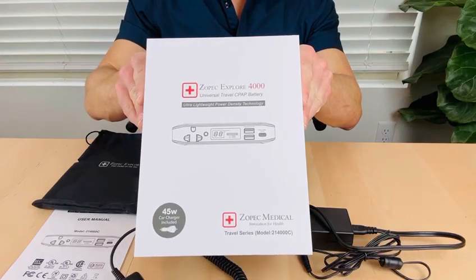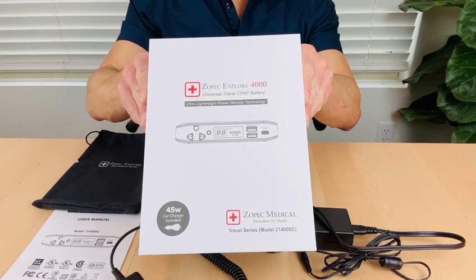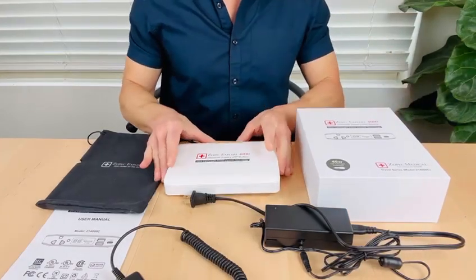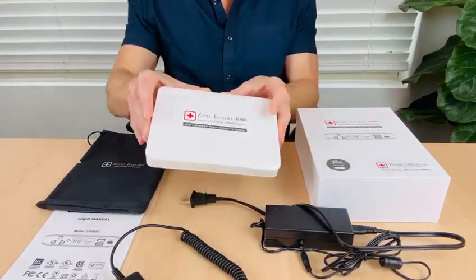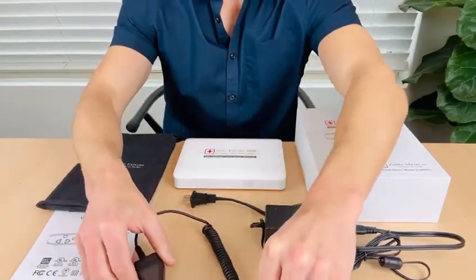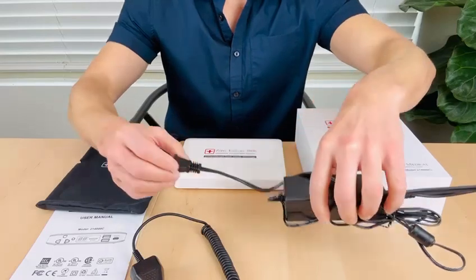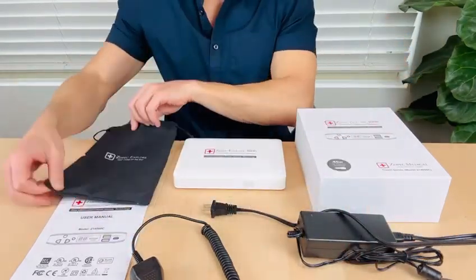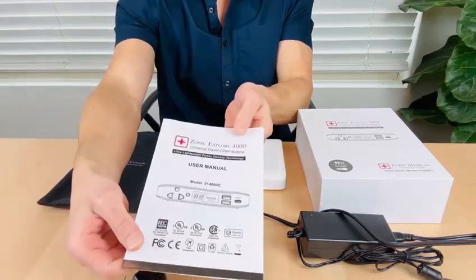With the purchase of any of our Explorer CPAP travel batteries, you will receive five items in your package: battery, fast car charger, power adapter, travel pouch, and user manual.